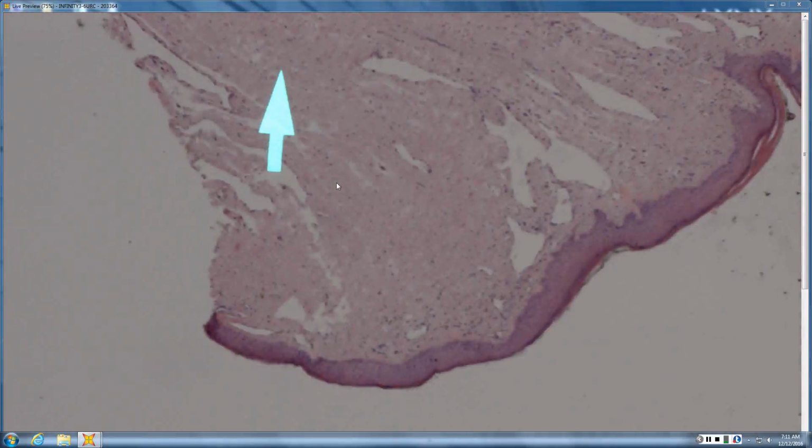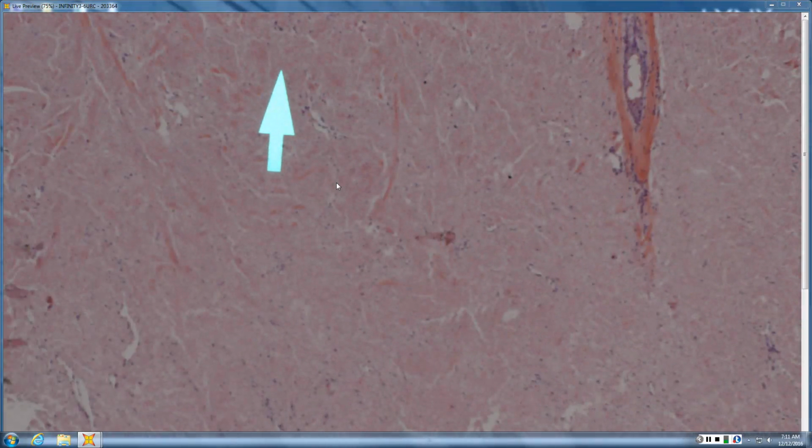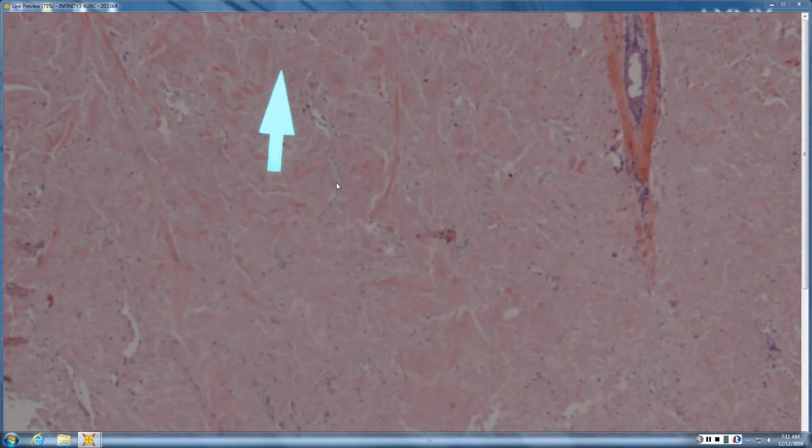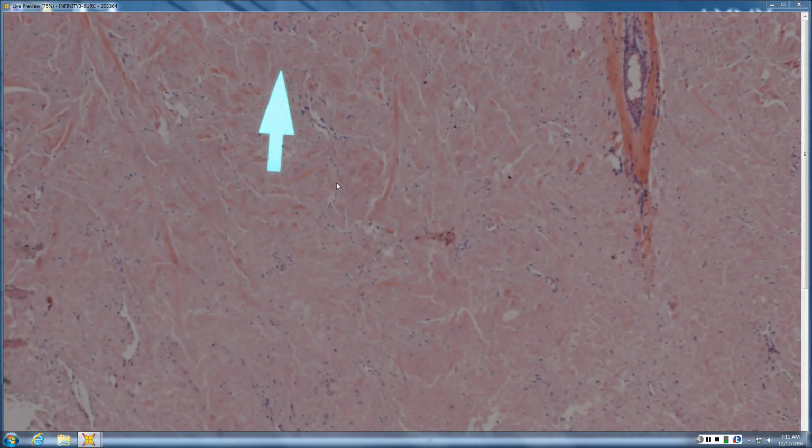How do you differentiate those? You'll stain, because lipoid proteinosis won't be Congo red positive. We will very rarely call amyloid straight out on an H&E. We want to prove it because there are a lot of mimickers. Sometimes you think it looks amorphous and acellular, and then you stain it and it's not really amyloid.